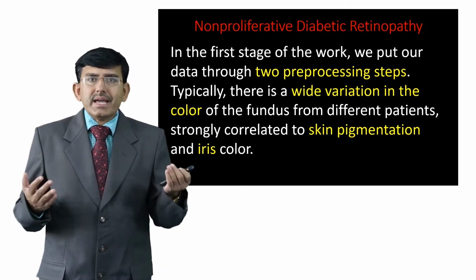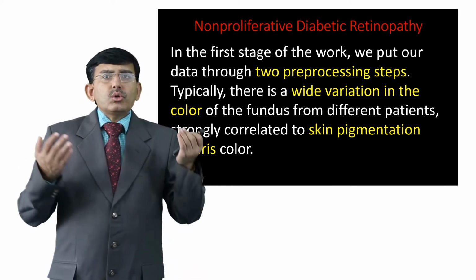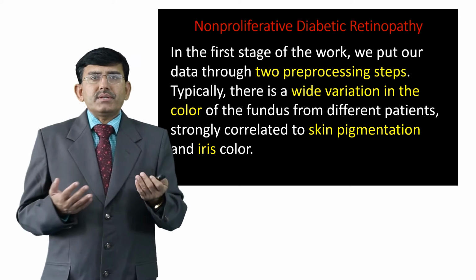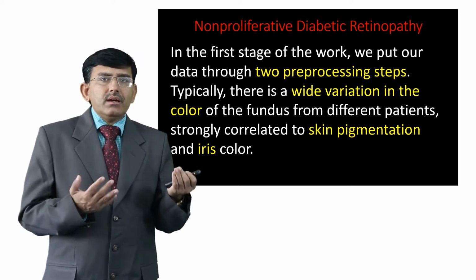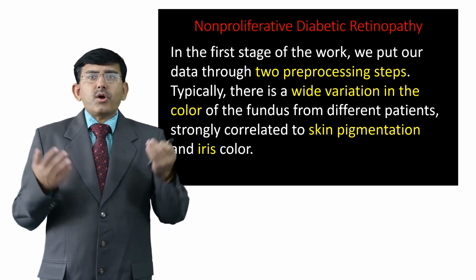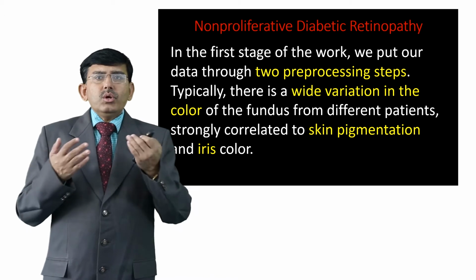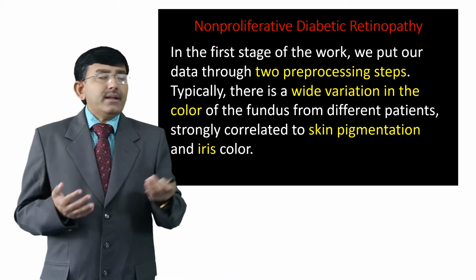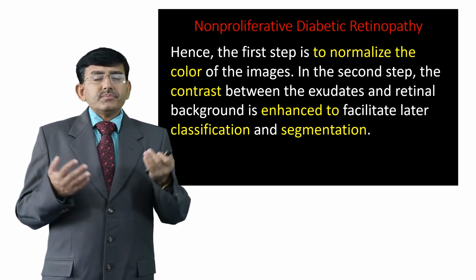In the first stage of the work, we put our data through two pre-processing steps. Typically, there is a wide variation in the color of the fundus from different patients, strongly correlated to skin pigment and the color of the iris of the subject.